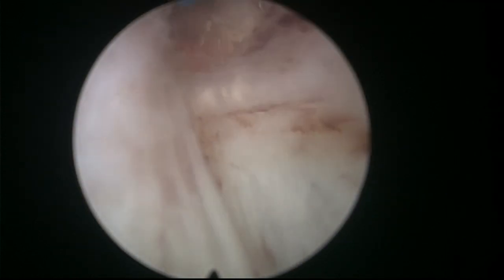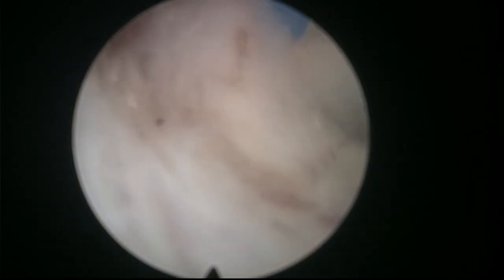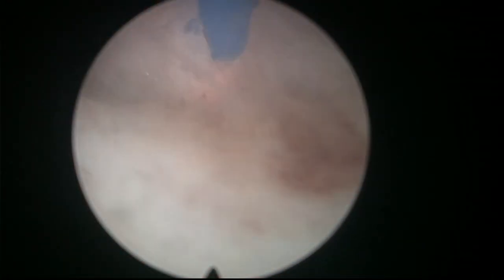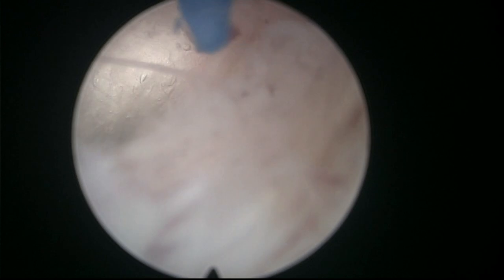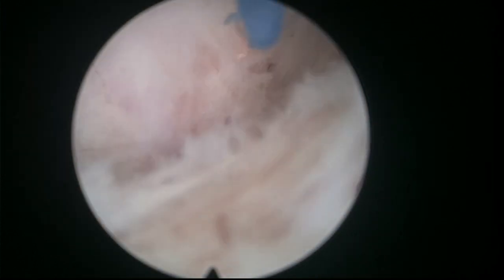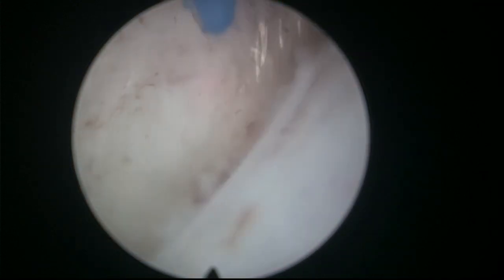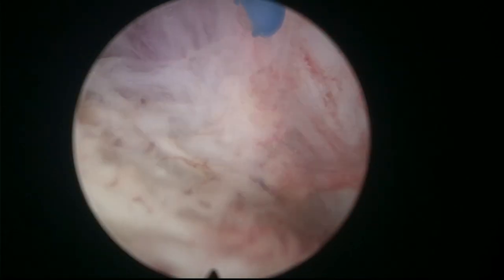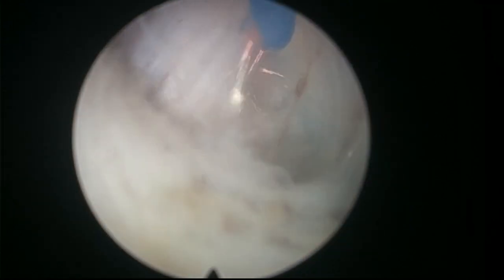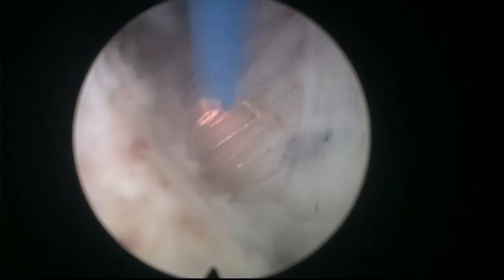You see, now most operations in this prostate, which is estimated as 60 grams, it looks a little bit bigger to me, but all these operations with a little bit of experience take you 40, 45 minutes, 30 minutes, 20 minutes. It's a very fast operation. It's very safe. As you can see, there's very little drama involved. Today we have scheduled 5 cases in the afternoon session. So you can do many cases in a short time. And these patients will have their catheter removed tomorrow morning. It's now 7 p.m. here in Madrid. And tomorrow morning at about 8, so in 12 hours, the catheter will be removed. And patients are able to go home the next morning.